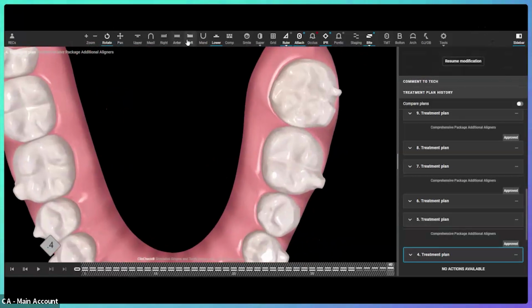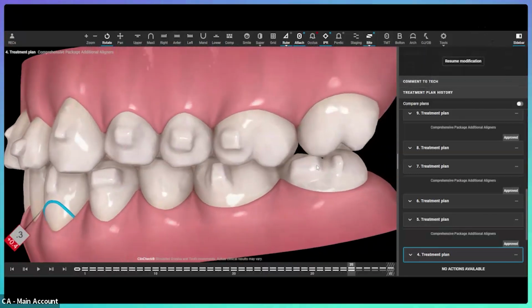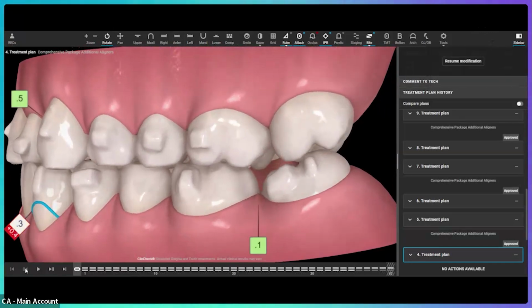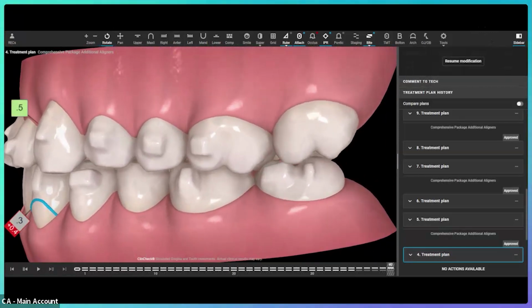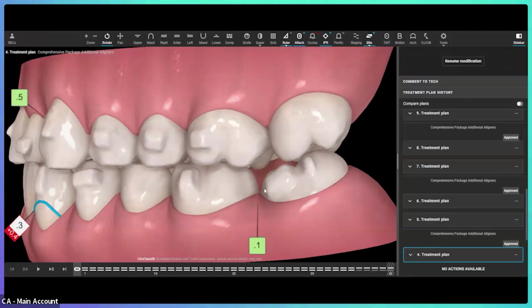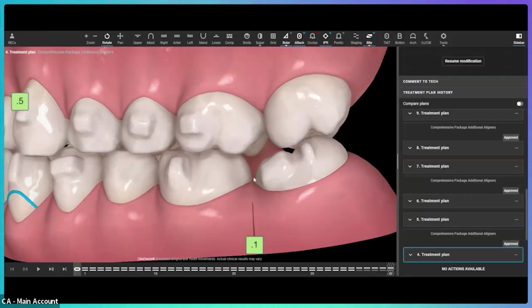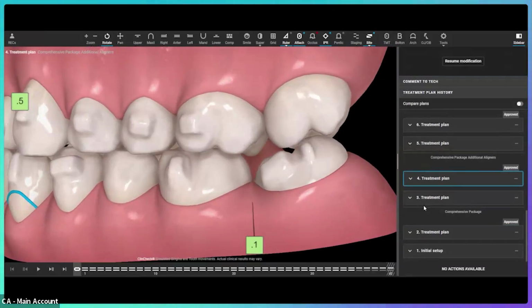We're trying to upright that tooth in 36, 35 aligners and swing that root through the bone. Like it's just not going to happen. Because we weren't successful in the first batch, well, we have even worse grip of the plastic now. When we had space around that lower molar, the plastic could grip around the entire tooth. But now we can't. The plastic will not grip on the mesial surface.